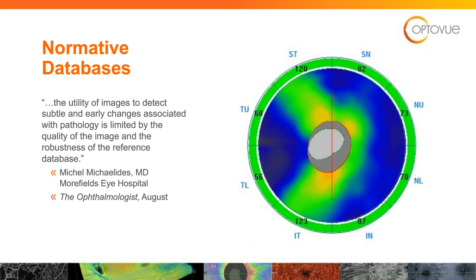And all too often as practitioners, we fall into that trap of saying, oh, look, it's green, it's fine, there's no glaucoma here, or red, it's not fine, they definitely have glaucoma. But we have to remember that this instrument, as good as it is, is a tool. It's an accessory to you as a doctor making the diagnosis of glaucoma conversion and glaucoma progression.